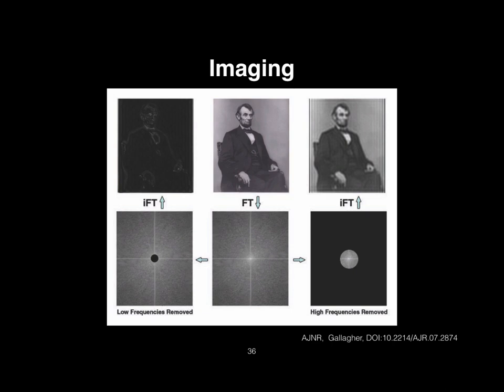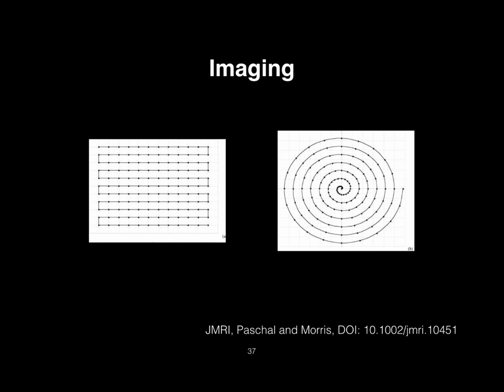Okay. So a couple of the trajectories that are most common for high performance imaging are echoplanar and spiral. And this here is an EPI trajectory. Similarly to the example we had a few slides ago, you start off in the middle. You have a couple of what are called prewinder gradients that get you off to the corner. Then you turn on your readout gradient here, turn it off here, add a little phase encode, turn your readout gradient back on, turn it off, phase encode, and you do that over and over again till you get through K-space.